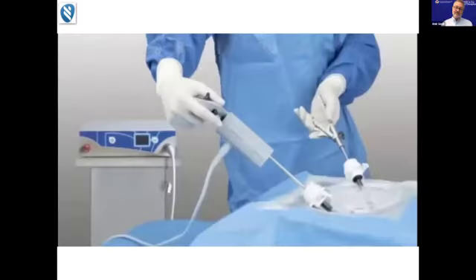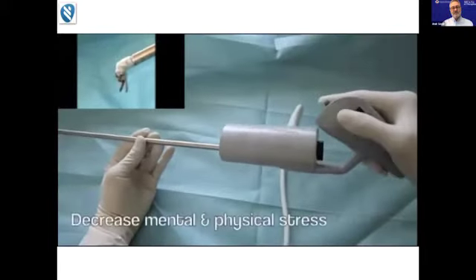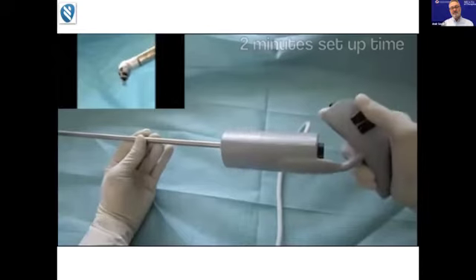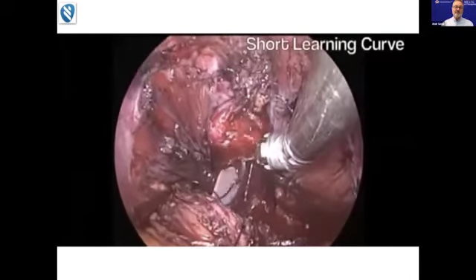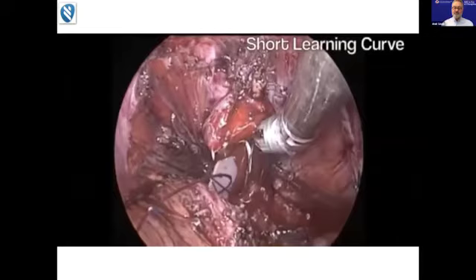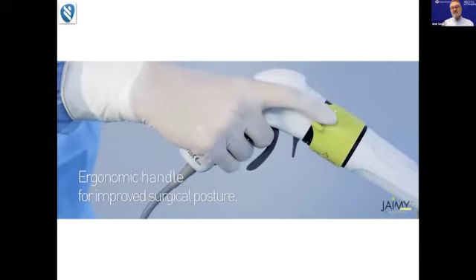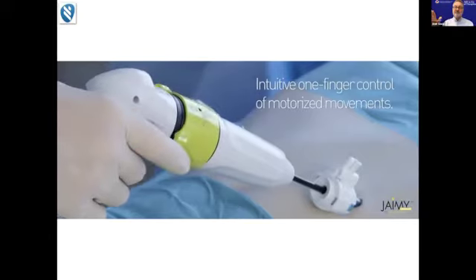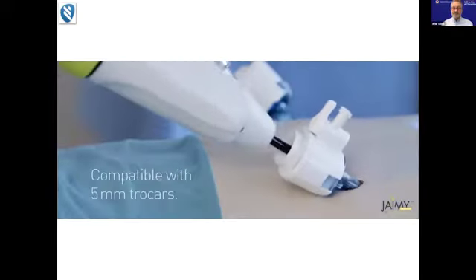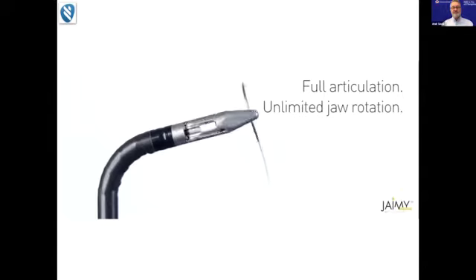There are several electromechanical devices on the market like that, but they are less intuitive, they're quite bulky, and most of them are needle holders. They do not allow you to perform a complex motion, more just articulation and rotation in a sequential order. So you can't really use your wrist the way you would use it in the real world. This one works with 5mm trocars. It's a French company, a very beautiful device as well.